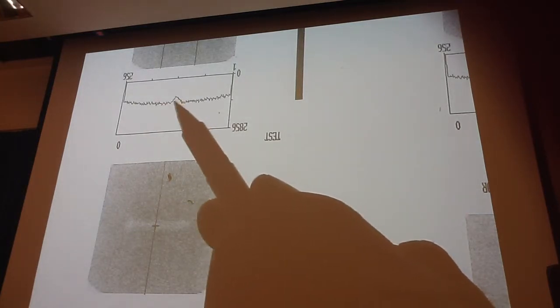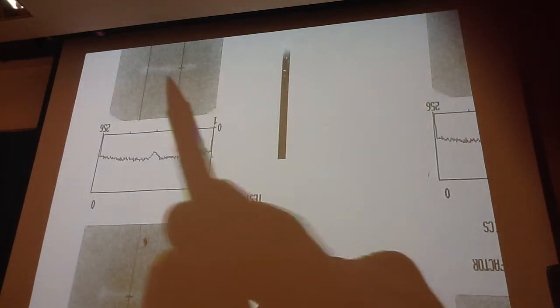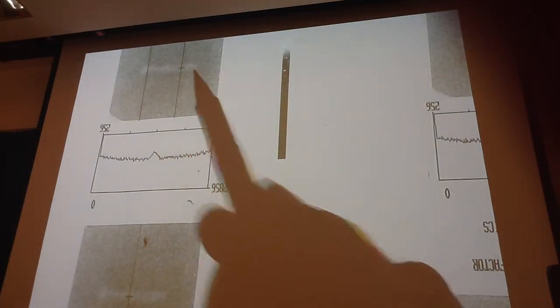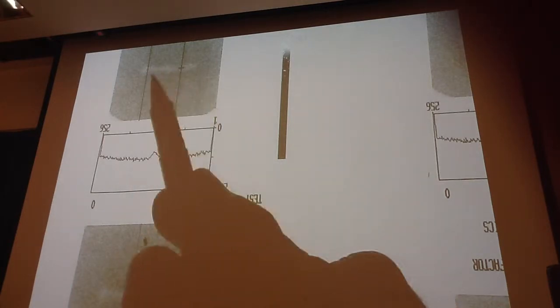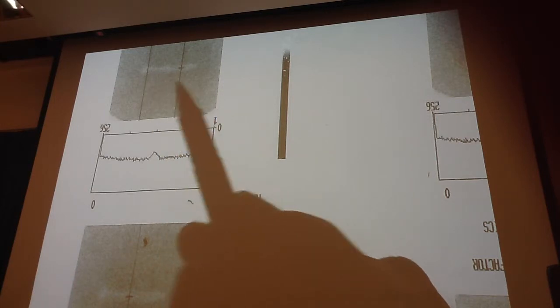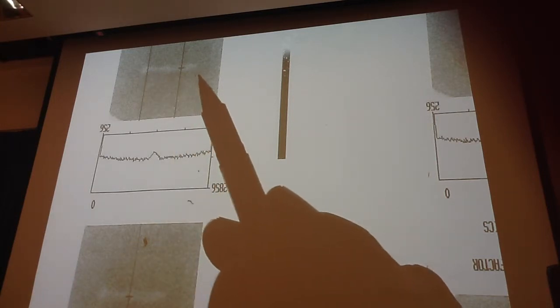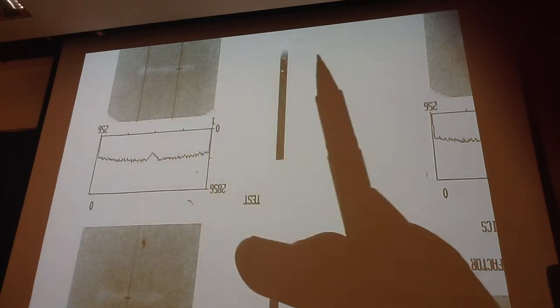Let's say that this measures 0.5 centimeters and this object measures 1 centimeter. That means that I've got a 50% resolution for that size of an object. This is how they can calculate resolution. That tells you the likelihood of you seeing a lesion or pathology or something at that size.